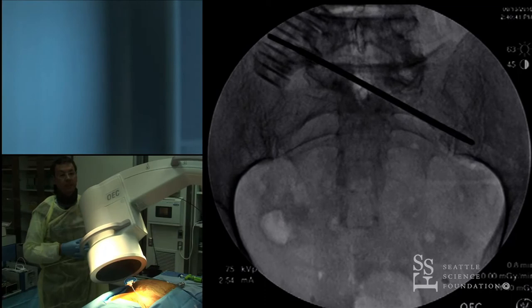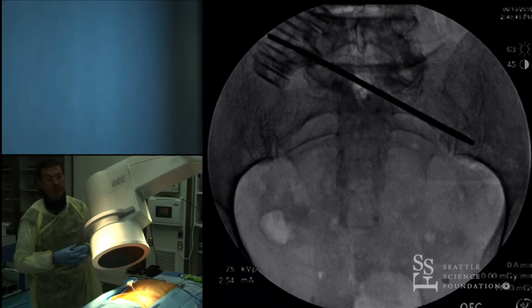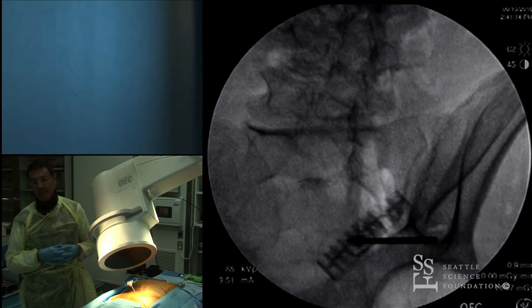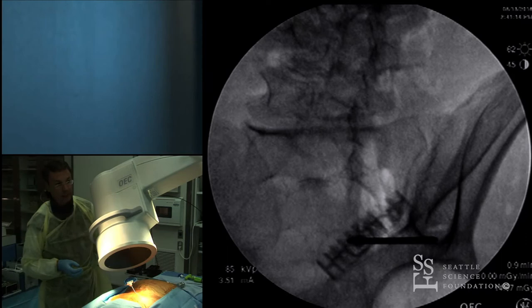If you have navigation you can use it, but if not, you need just regular fluoroscopy: the AP view and the teardrop oblique view. Looking at the teardrop image, the Jamshidi needle is at the bottom of the teardrop. The goal is to stay inside the teardrop — instead of going from top to bottom, we go from the bottom and work our way up, making sure we don't go too lateral.